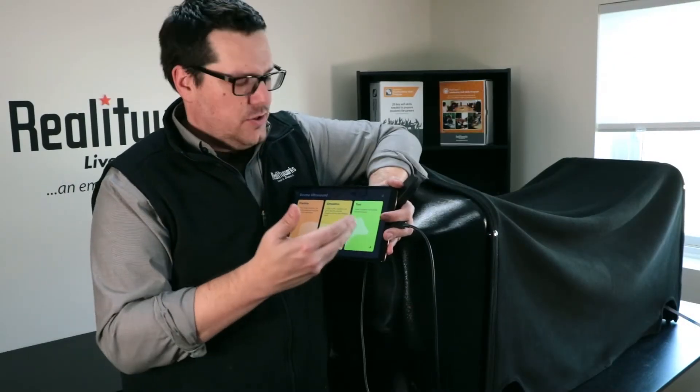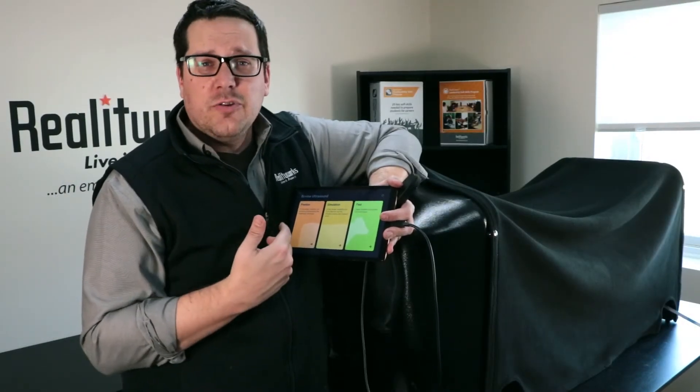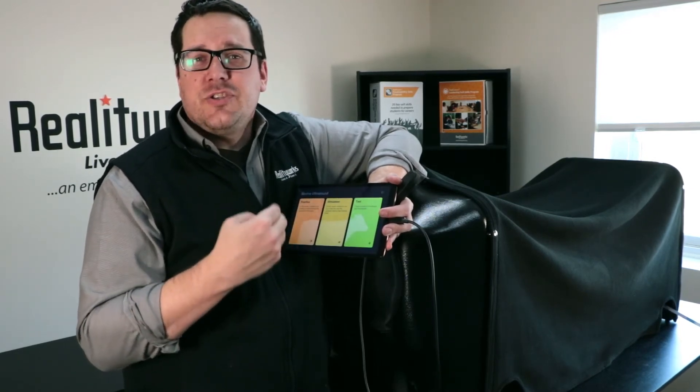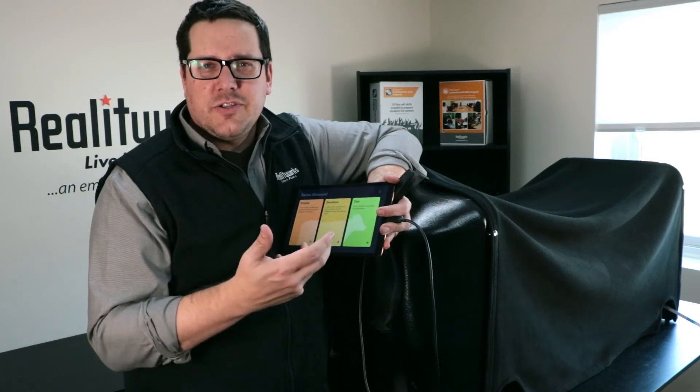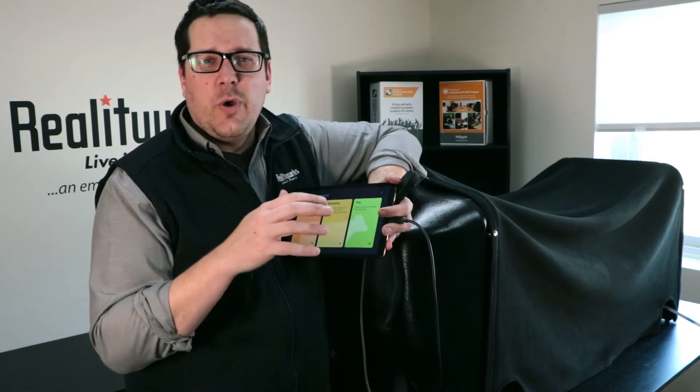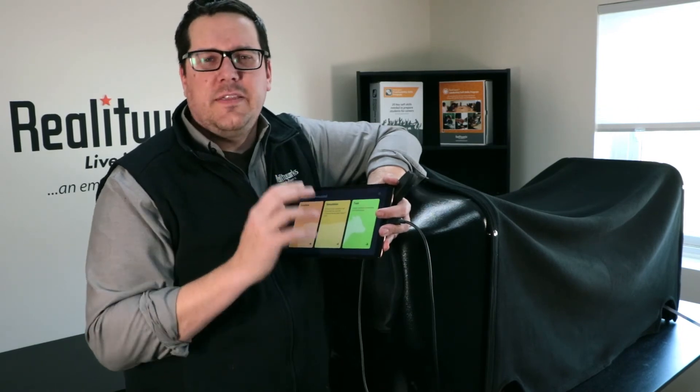There are practice, simulation, and test areas allowing your students to get lots of practice and understand what's happening inside. In simulation mode there are different features and scenarios for them to work through, and in the test mode they go in, look around, and decide what they think they're seeing.